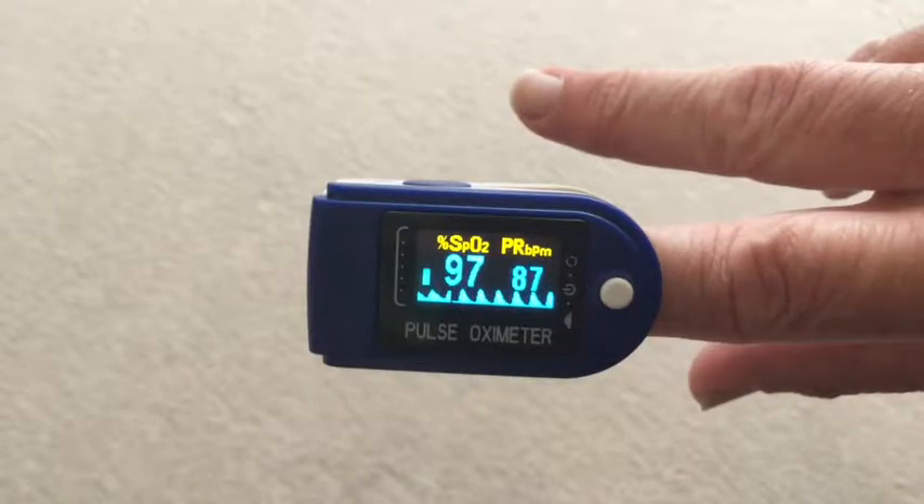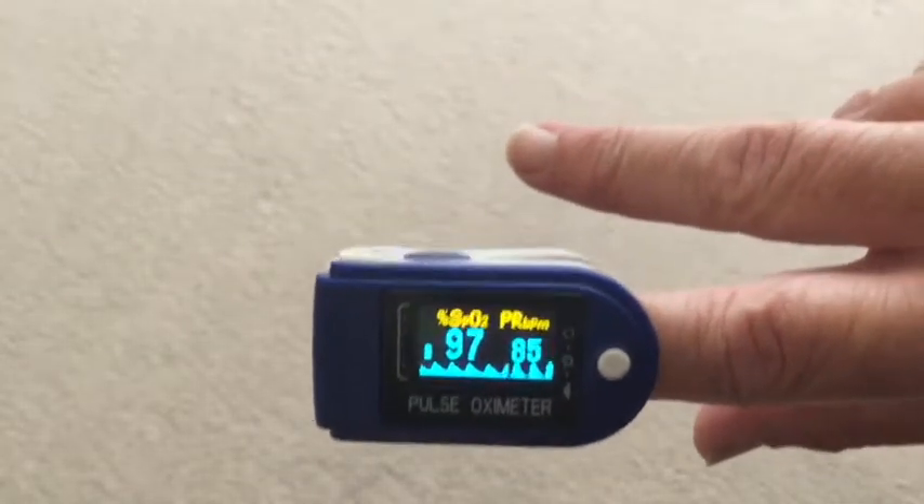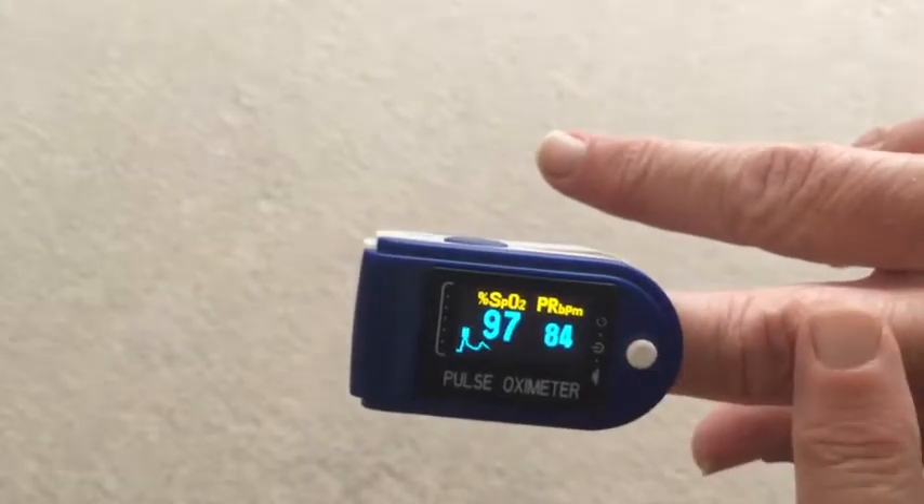I've paused it just a moment to explain the figures. On the left, percentage SpO2 97 — so 97% oxygen in my blood — and on the right, PR BPM, pulse rate beats per minute, at 87. The SpO2 level is sandwiched between the pulse rate on the right in numbers and that pulsating bar on the left.